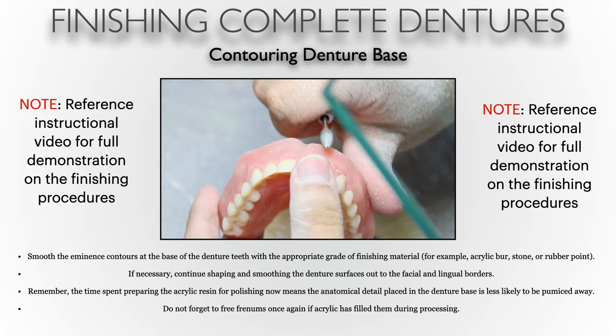Now we're going to contour our denture base — smoothing the eminence contours and the base of the denture teeth with the appropriate grade of finishing materials, in this case a fine carbide burr. If necessary you can continue shaping and smoothing denture surfaces like the facial and lingual borders. Remember that time spent refining the acrylic now means anatomical detail placed on the denture base is less likely to be pumiced away. A lot of these contours should have been done in wax, so the entire finishing process should not take more than 10 to 15 minutes, possibly less. Some technicians prefer to carve all anatomy post-processing, including all root eminences and basic contours.